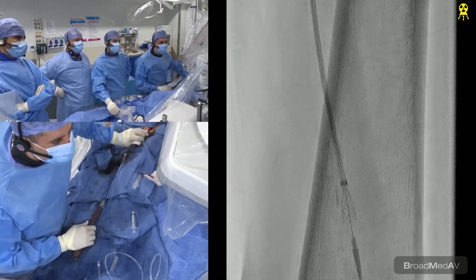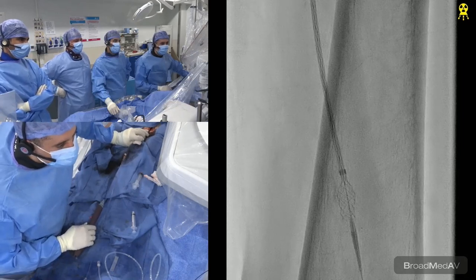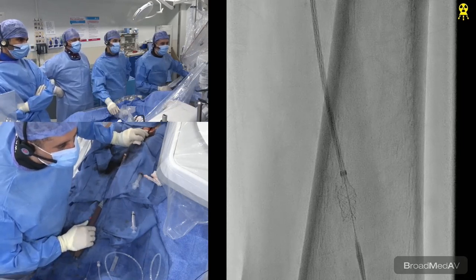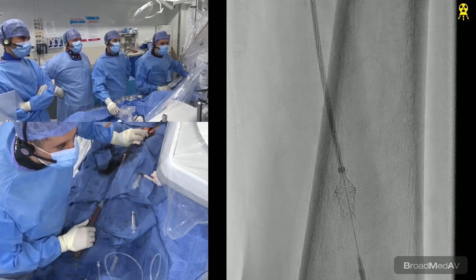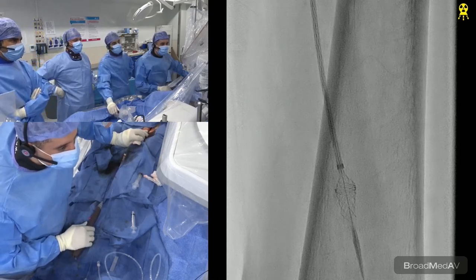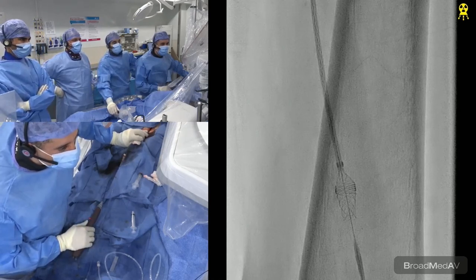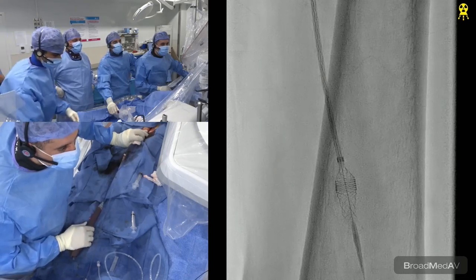Forward pressure with your left hand. Beautiful. So there he goes. Now he's going to try to stack it. You have a little bit of elongation distal, which is very hard with this stent to avoid. And now Vishal is going to try to just stack it. We prepped it so well with a 7-0 balloon that I don't think this will be a problem at all, especially since there's no eccentric calcium.